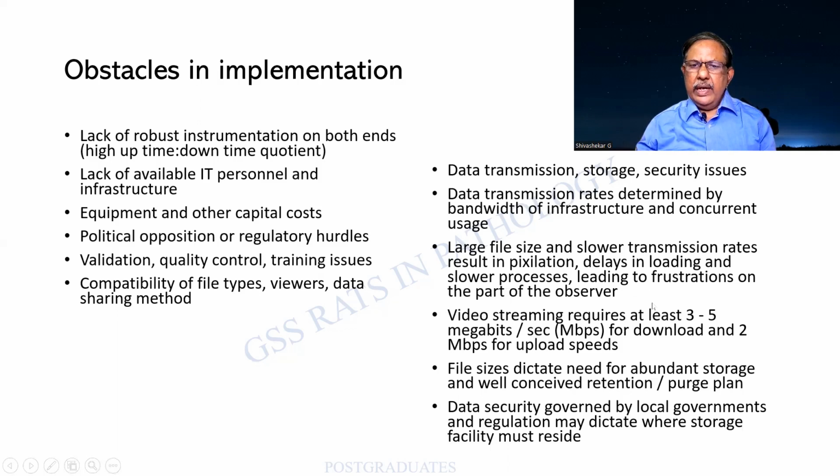You find that the larger the file size, the slower will be the process, and hence there has to be a very judicious use of this. Video streaming will require quite a large size. All this will have to be taken into account. Also, you will not be able to have a complete picture of all this. As I mentioned earlier, it is governed by the local governments on either side, from which I should get the permission or clearance whatsoever. These are the obstacles in implementation which you people shall definitely note down and write.